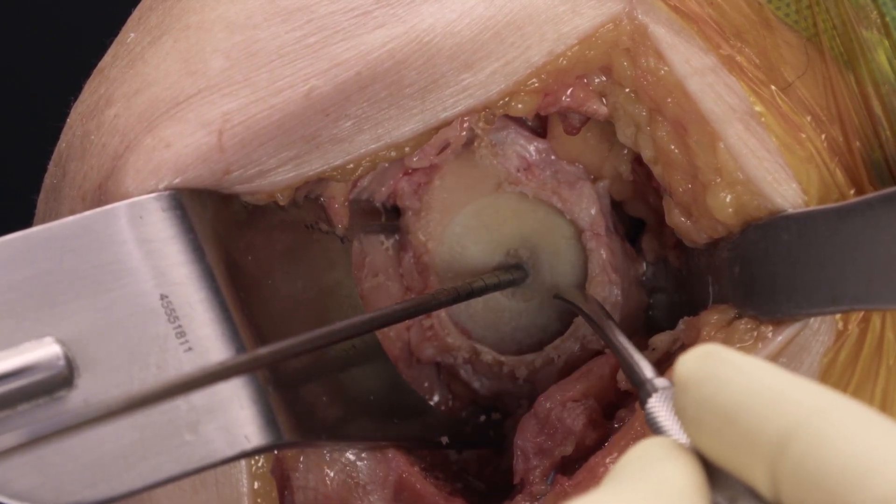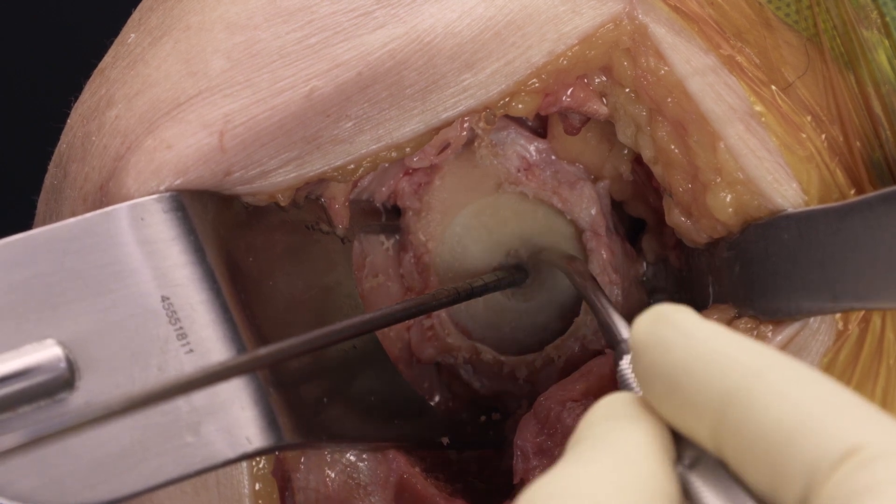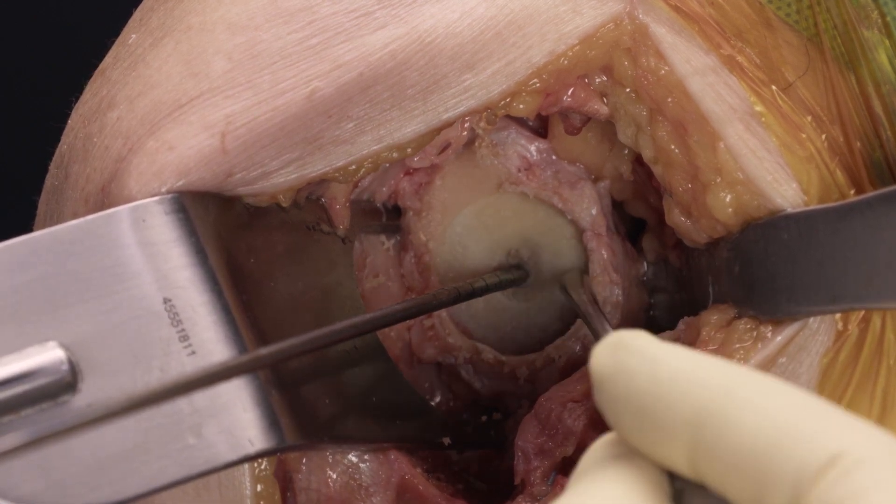We would then proceed with our standard MGS implant technique of reaming for the central screw or post and placing the base plate.